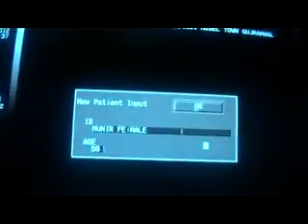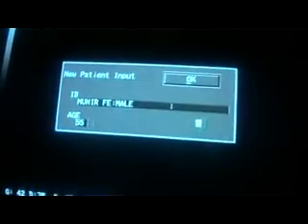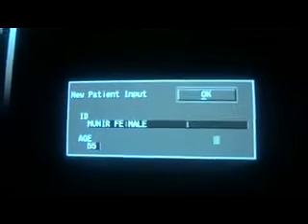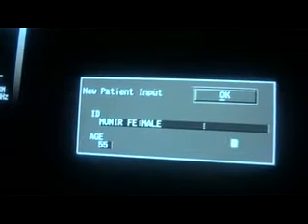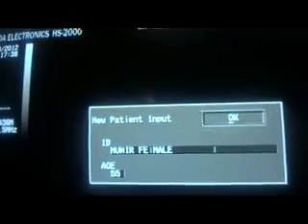This female patient was referred to me with severe pain in the right hypochondrium and high temperature with shivering, rigors rather. So starting the ultrasound to see the gallbladder, because such findings are usually seen in cases of gallbladder pathology.